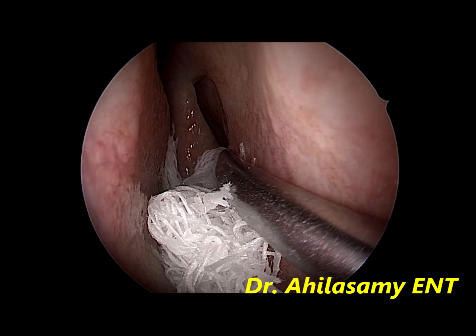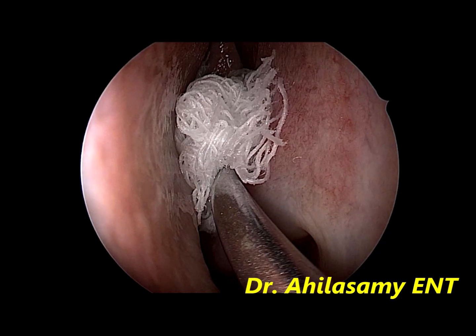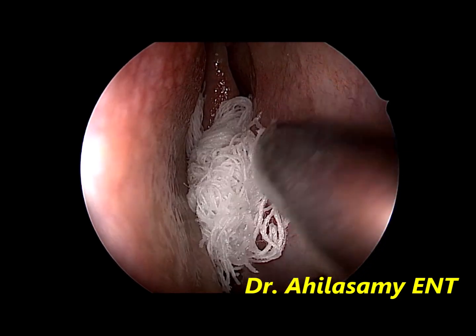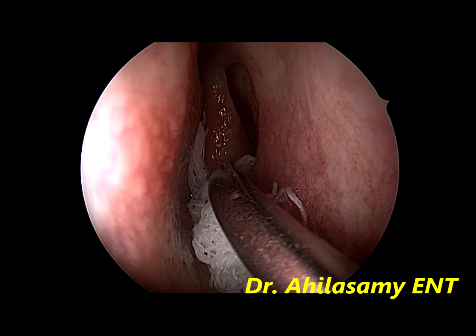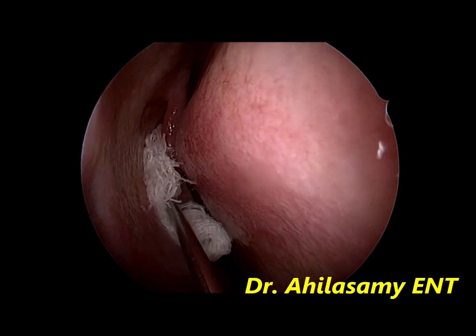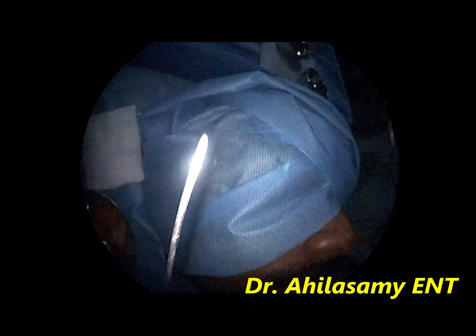Again, you pack this sphenopalatine area — that is the middle meatus — very well with a roller pack soaked in 4% lignocaine and adrenaline repeatedly, to get very good decongestion and enough space to give the sphenopalatine block. This is done on the right side.